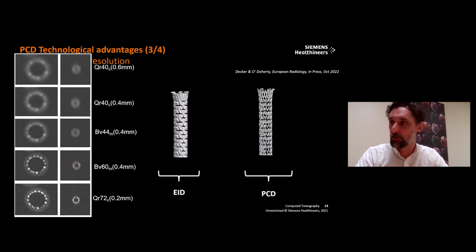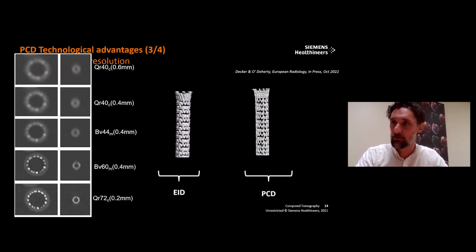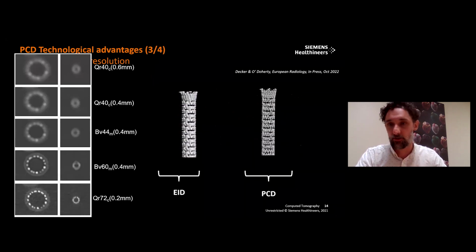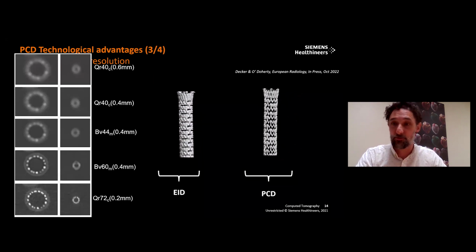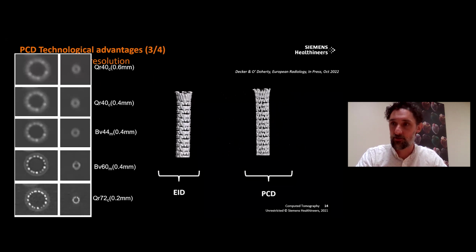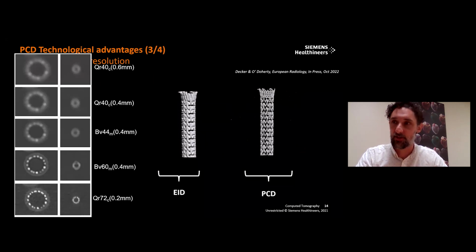In the cardiovascular space, we've done a lot of stent imaging. So these are ex vivo stents. These were scanned within a water phantom, and you can see that using the photon counting system, the resolution is much more improved for the same size stent. The image on the left essentially is 2 stents, a large stent on the left, which is about 7.5 millimeters, and a smaller one to the right of that, which is 2.5 millimeters.